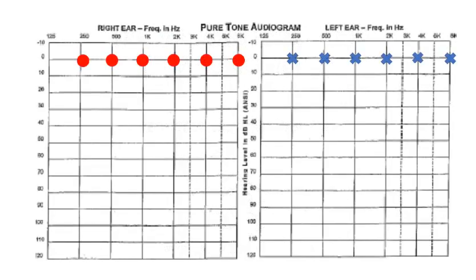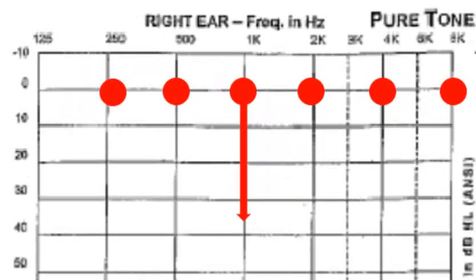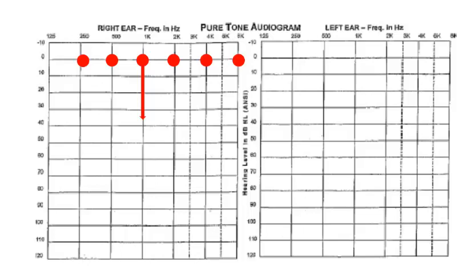Let's consider a subject who has really great hearing. If we introduce a pure tone signal into the right ear at 1000 Hz with an intensity level of 35 dB HL, this subject will easily be able to detect the tone. We can even characterize this as a 35 dB sensation level signal. Sensation level refers to the intensity level that a signal exceeds a person's hearing threshold. So a 35 dB HL tone is definitely audible.